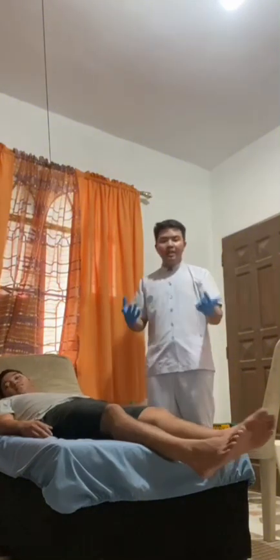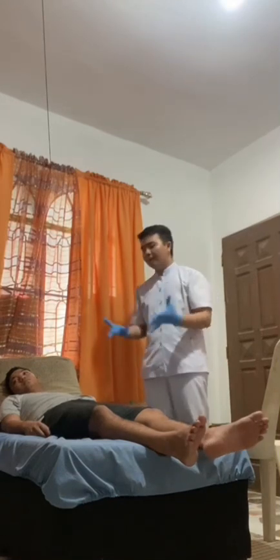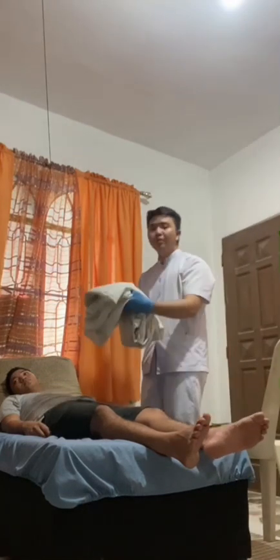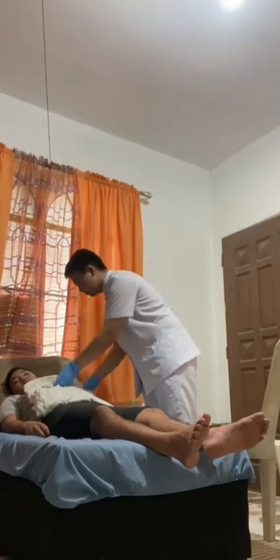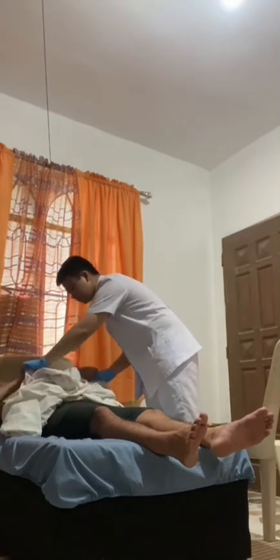Okay. Before putting the top linen, I will make sure that the machines that are with the patient, like IV lines and call bell, are with the patient. I will now put the top linen on the patient. Sir, can you hold this? Yes, sir.